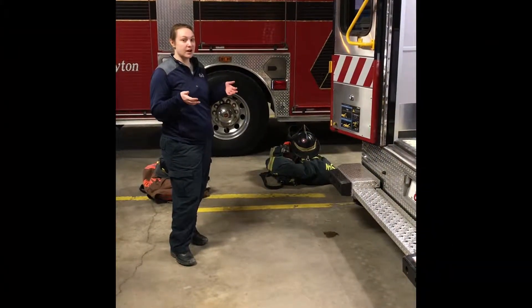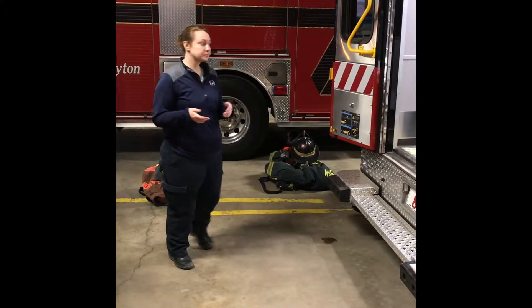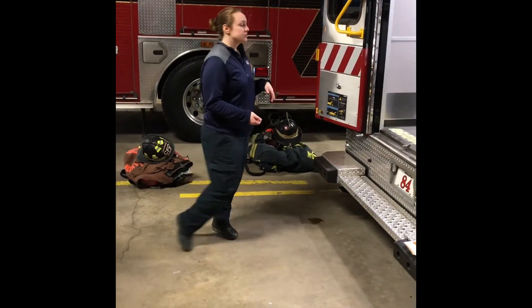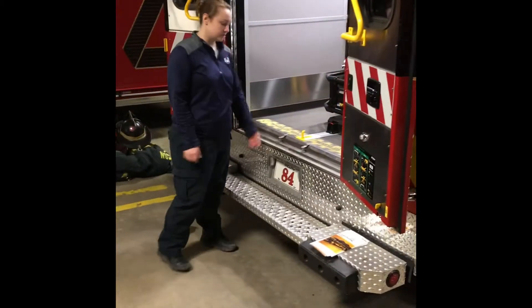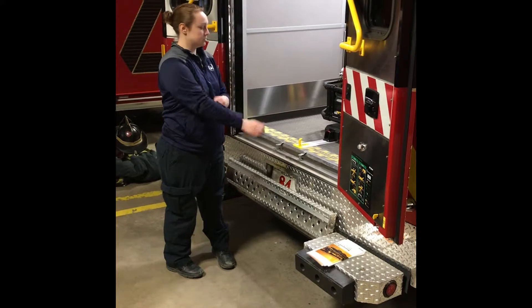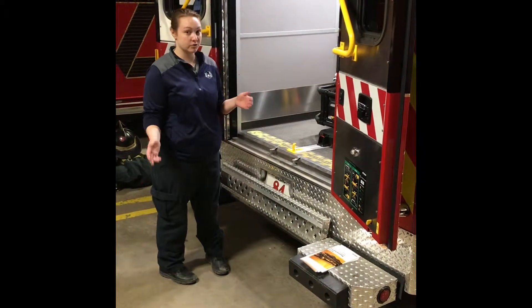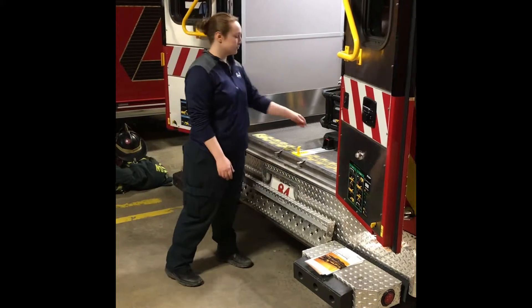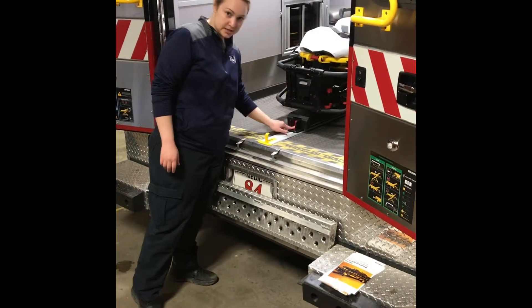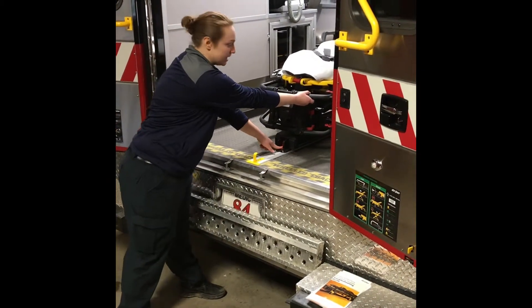Today we're going to be going over how to use the Stryker power pack in the power load system. The first thing we're going to do is go over how to unload. First, make sure this is up — it's not going to come out correctly if it's down. So the first thing you do is this little red release lever. Push it down, and then you're going to pull the track out.